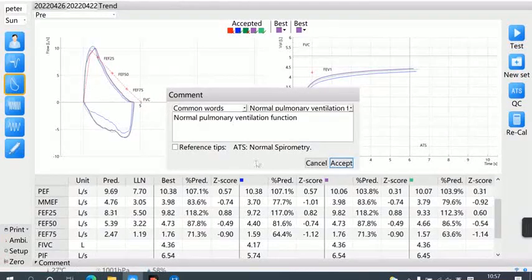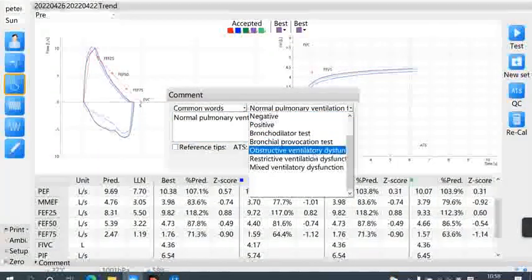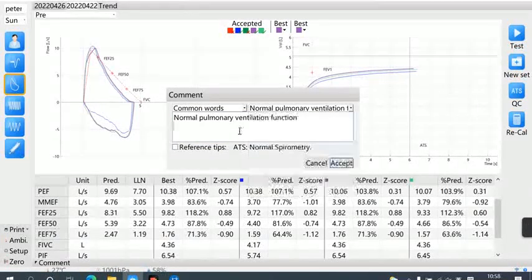You can directly enter the diagnosis results in the diagnosis box, or check the reference prompt to use the results generated by the system. You can also directly select the corresponding result in the common words in the upper right corner of the comment box. Click OK to save the results.